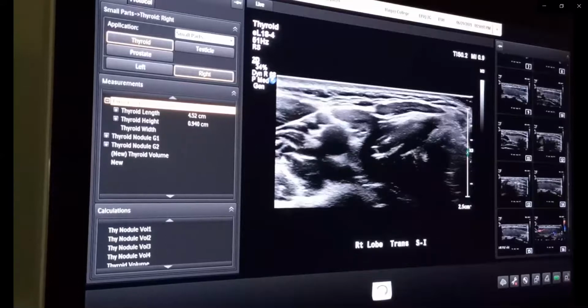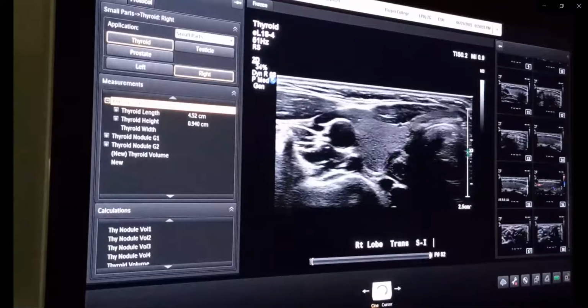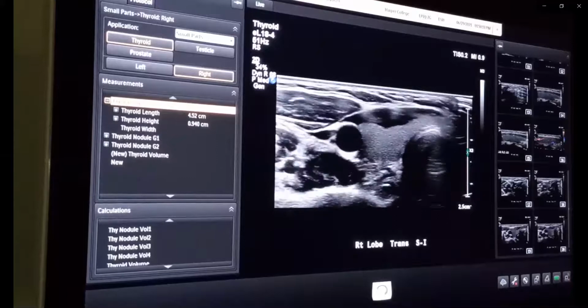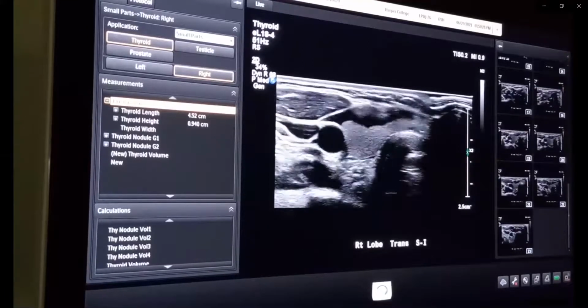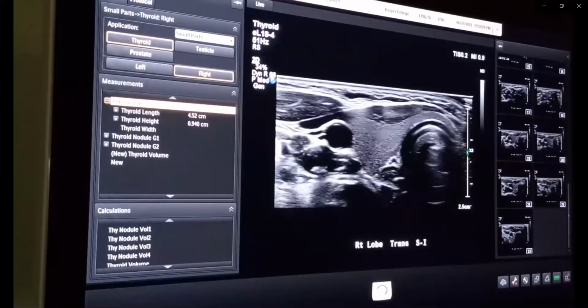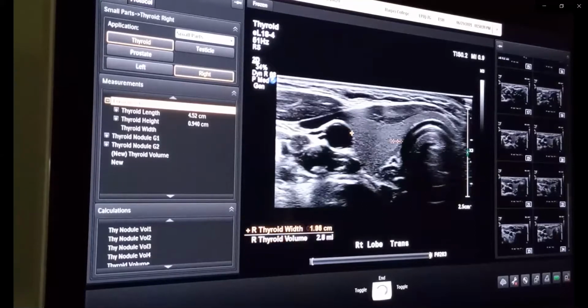If we have pathology on a patient's thyroid gland, we can measure on transverse and longitudinal view and then put color on it and report. But on this patient, I cannot find any pathology on the right lobe. So I took all the sweeping images, and I got the widest area to measure width, from the common carotid artery to the trachea.